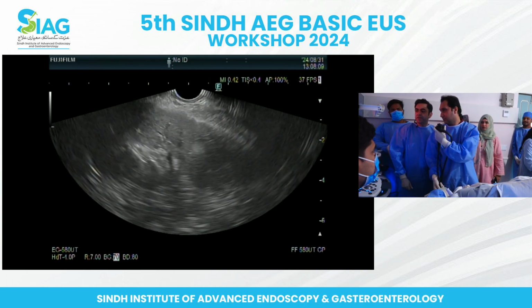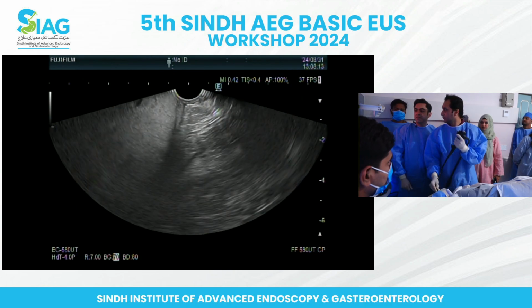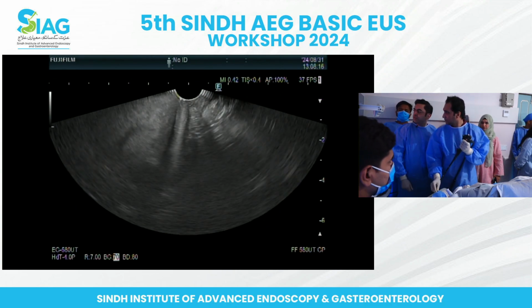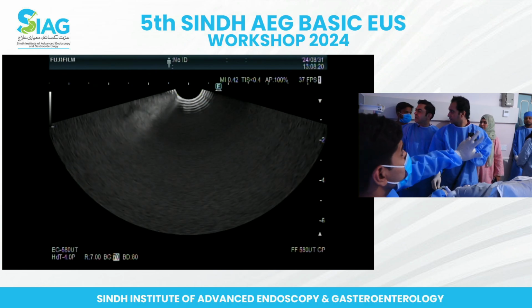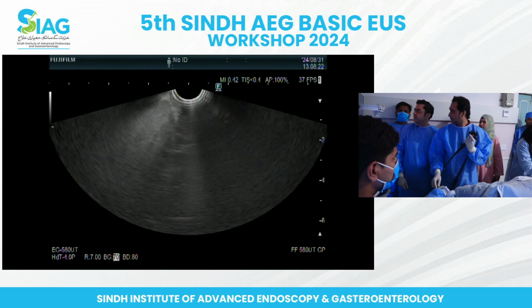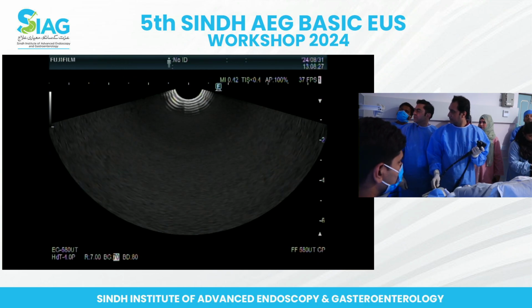Okay. So I think you're further down. That looks like the kidney to me. Okay, start rotating. Are you in D1? Yeah, I think you're too far in now. Just pull back with the scope. Let's see where you are.